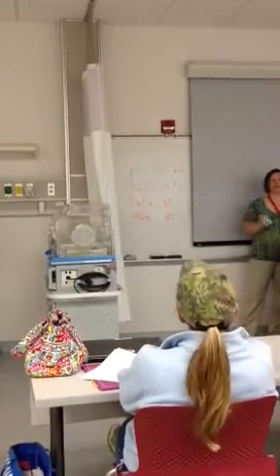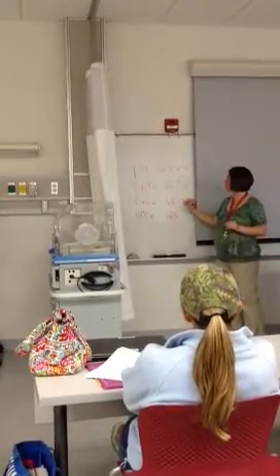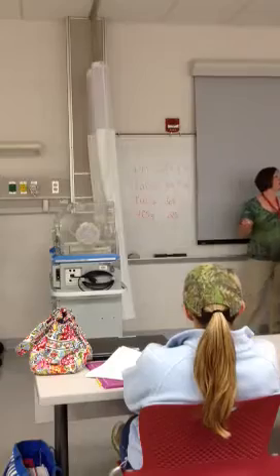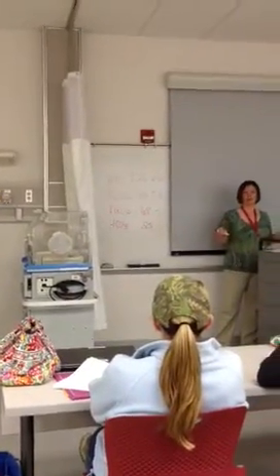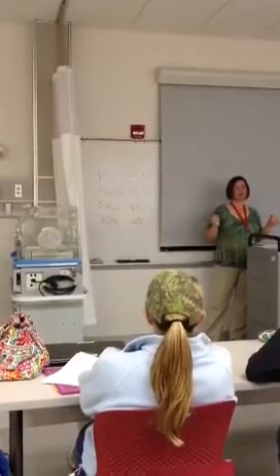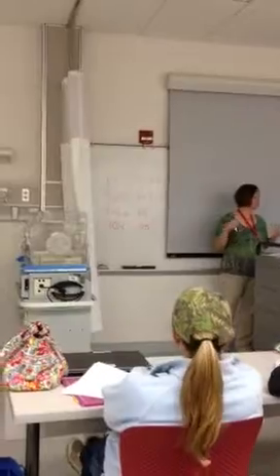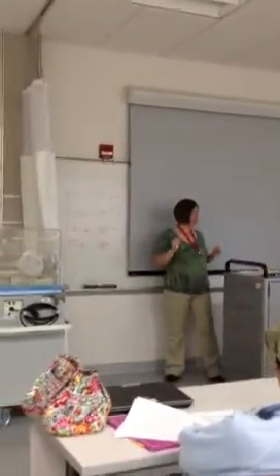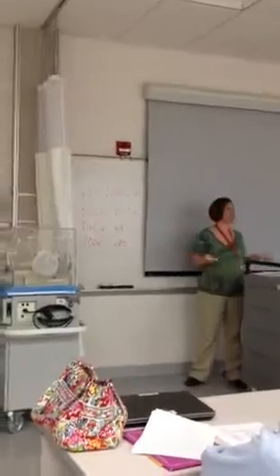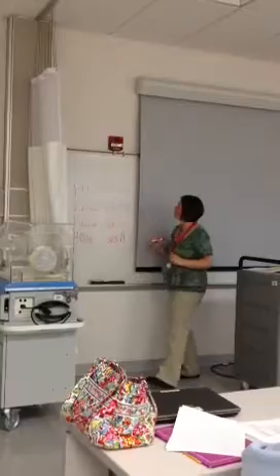Is that out of your normal range that I gave you? Yes, it is. Okay. So we'll just put it's out of range. So what do we call that when it's lower than normal? They're hypoxic, right? But there's different ranges, and like I said, that's further into blood gases than we want to go today. But we'll just say they're a little bit hypoxic. And then the bicarb is 25. So is that normal? Mm-hmm. Okay, that's normal. So I'll put it in there for normal.